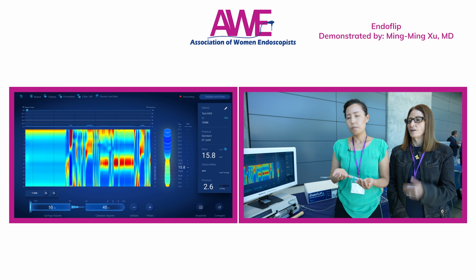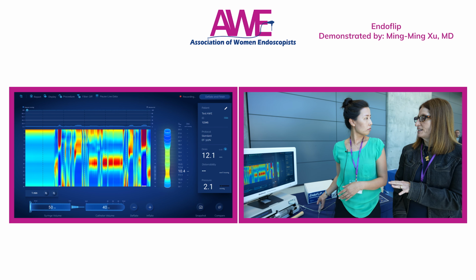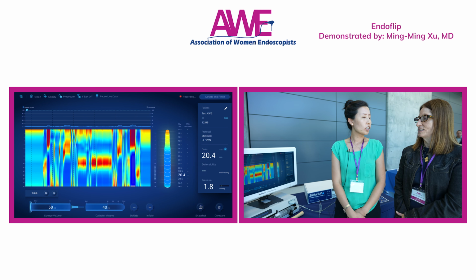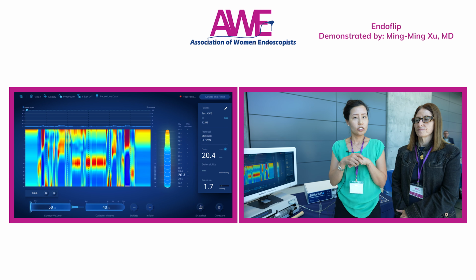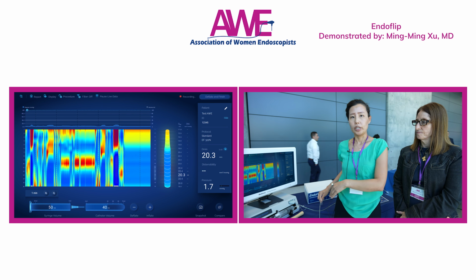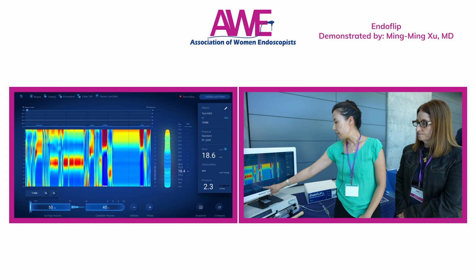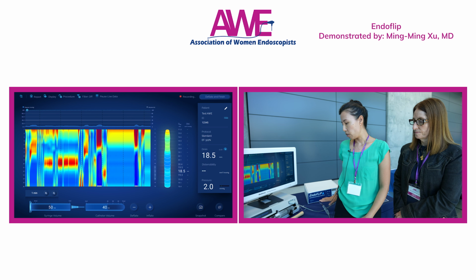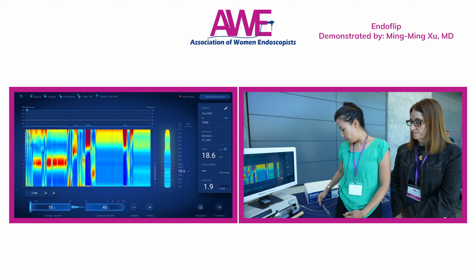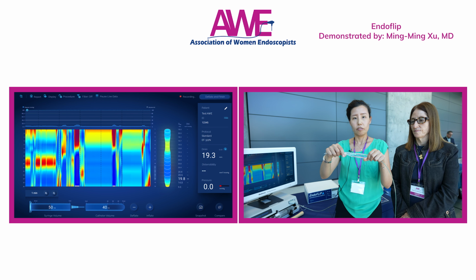So for our novice endoscopist, we introduce that, obviously not inflated, through the channel of an endoscope, and how do we position within the esophagus? Good question. This is actually not inserted through the channel of the endoscope, it's inserted through the mouth orally. This device has already been primed, at 40 mils of inflation, which is the catheter volume, and it's inflated through a syringe that contains saline, pushed through the catheter into the balloon to a preset mils of inflation.